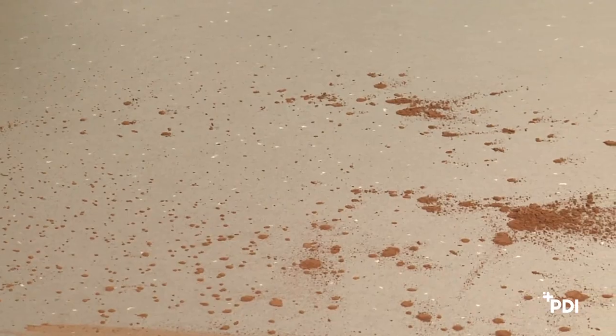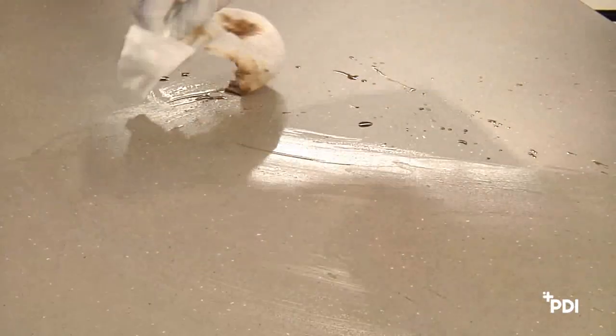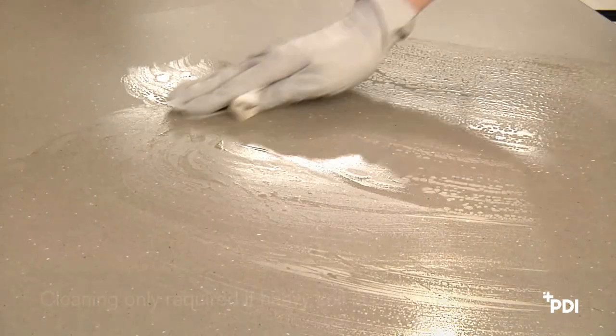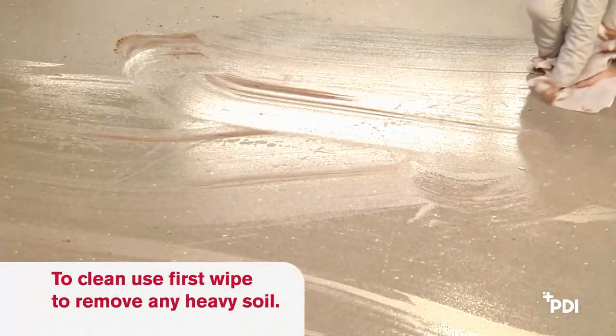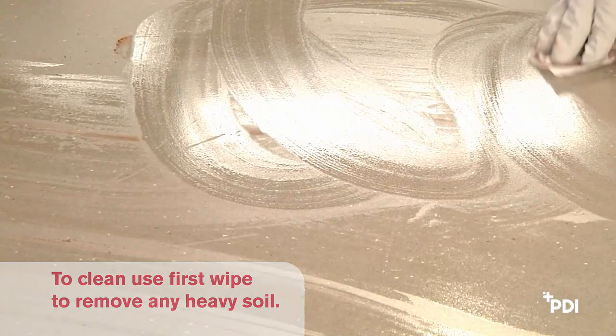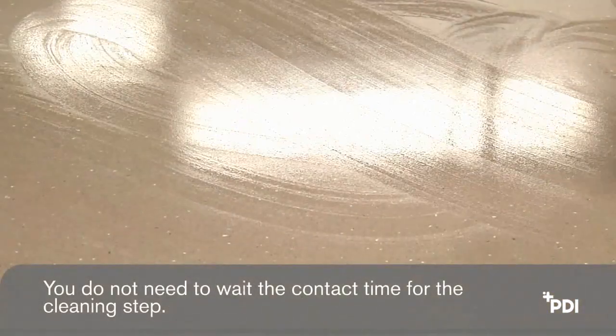Step 3: Cleaning. Before wiping a surface, determine if there is heavy soil present. If you can see dust, dirt, blood, or other organic material, you will need to clean prior to disinfection. This step is required only if heavy soil is present. Use the first wipe to remove any heavy soil from the surface, using more wipes if necessary. You do not need to wait the contact time for the cleaning step.